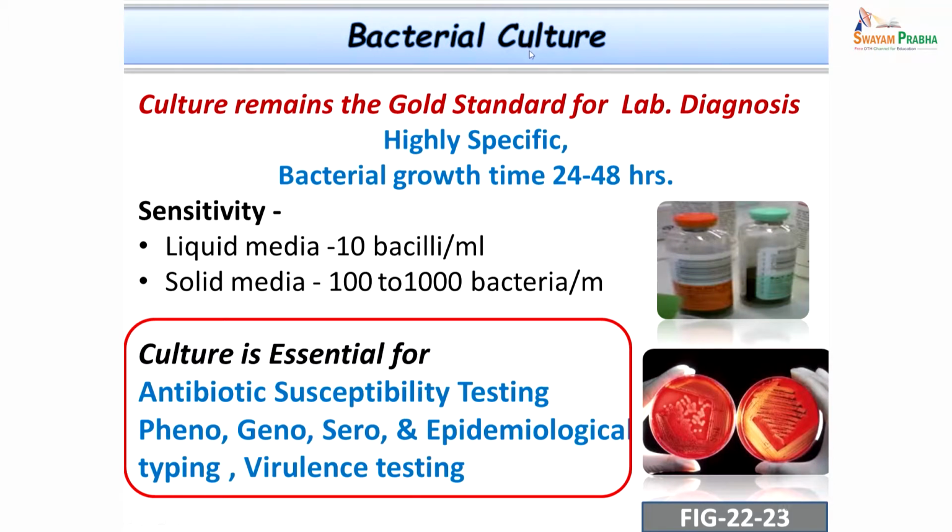The bacterial culture is the next important step in the laboratory diagnosis. We have just subjected our specimen to gross examination, microscopy, and stained and unstained preparations. Now comes the bacterial culture.